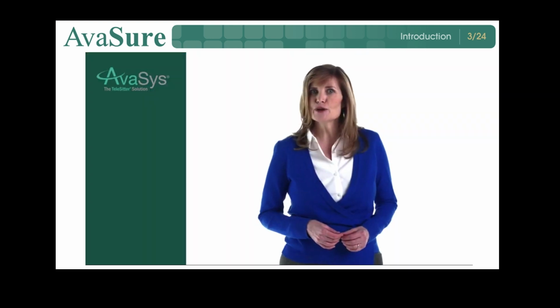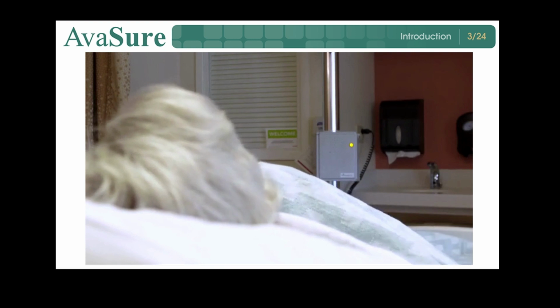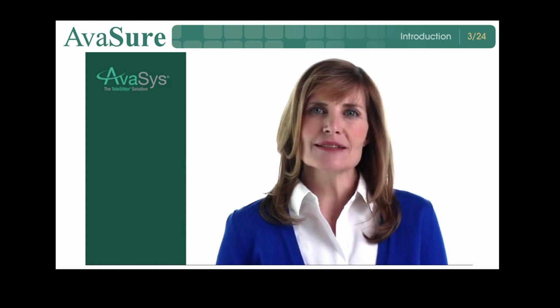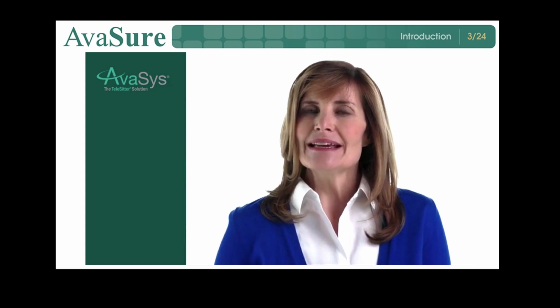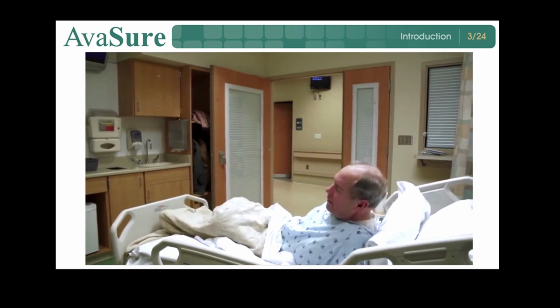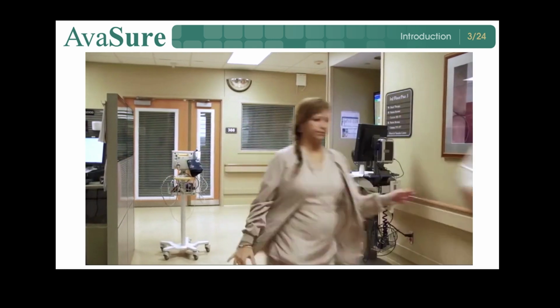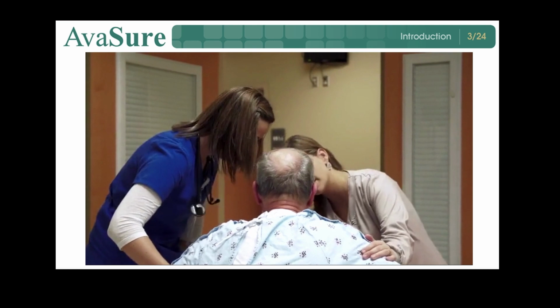The audio communication is immediate, takes no time, and is very effective at reminding the patient to stay put until help arrives. The monitoring unit also has a stat alert alarm, which sounds in the patient's room. It is activated by the observer when their trained eye sees something they determine to be imminently dangerous. When the alarm sounds, all available staff in the area must respond immediately to the patient's room.